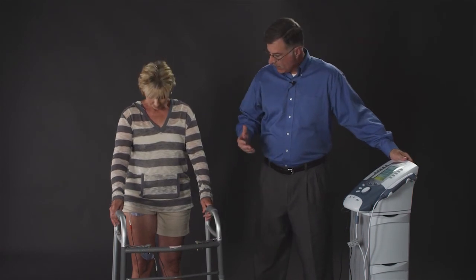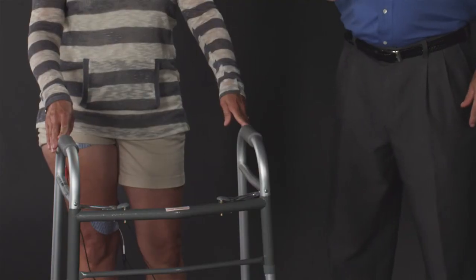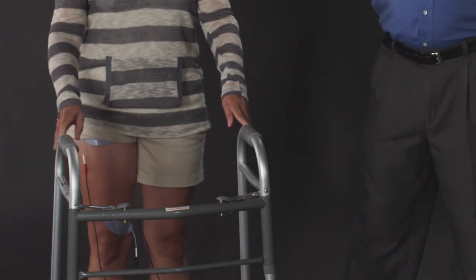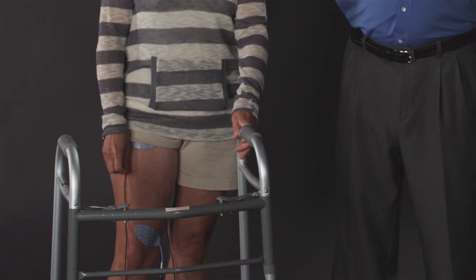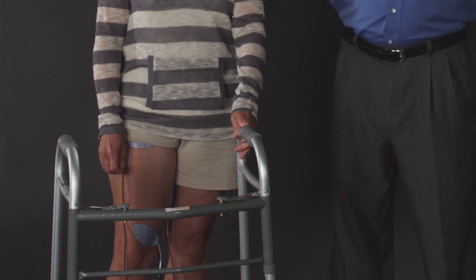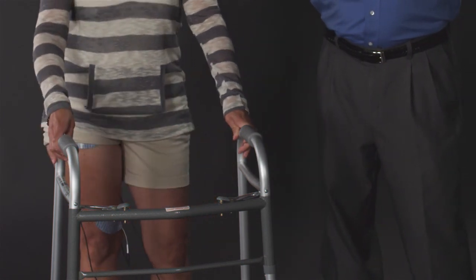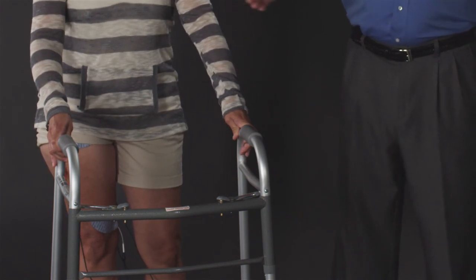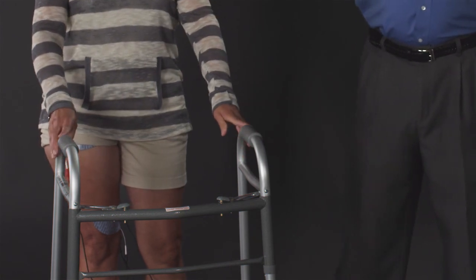And now as the unit cycles on and both muscles contract, I want her to shift her weight to the bad leg. And when the unit turns off, we want her to shift her weight back to her non-surgical leg. When the unit turns on, she will shift again her weight to the surgical leg. Again, the current is stabilizing both the hip and the knee. This is giving her comfort to shift her weight to that leg. And now when the unit turns off, she will shift back.